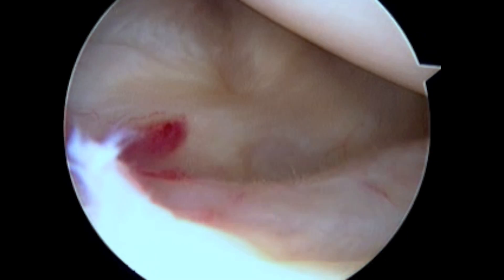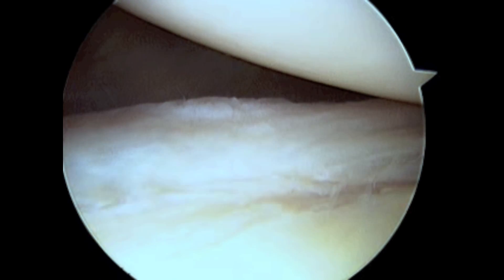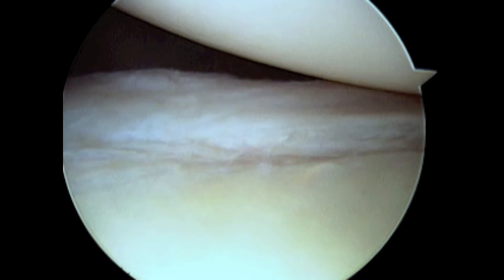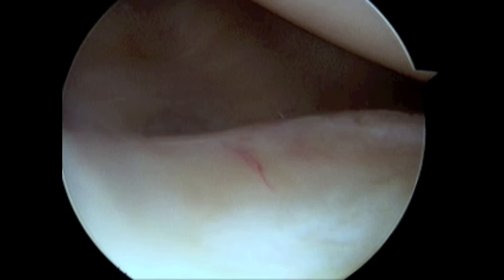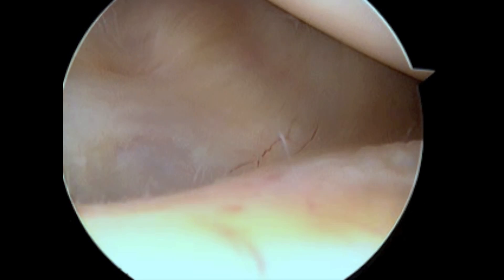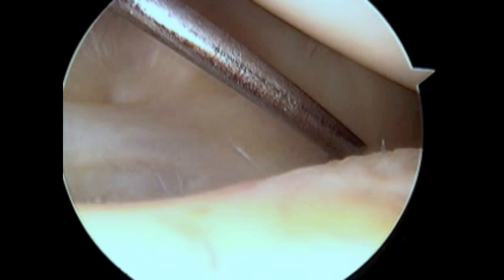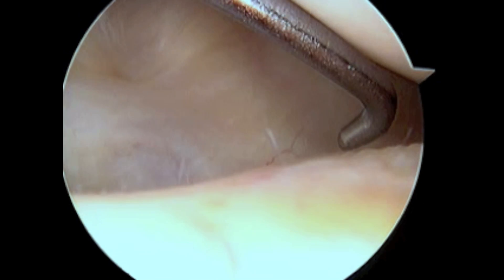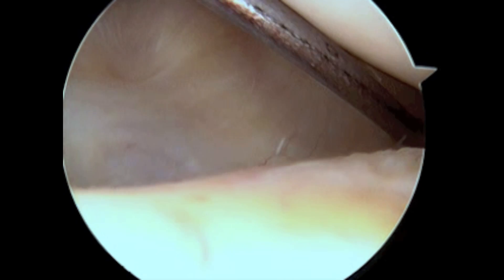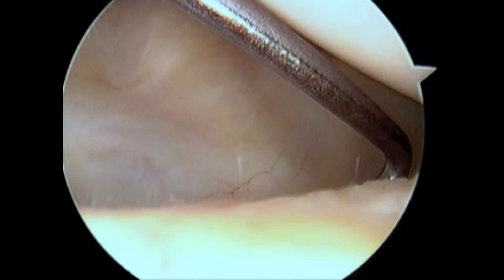As we advance the arthroscope anteriorly and inferiorly, you can visualize the inferior glenohumeral ligament, which originates as a portion of the fibrous glenoid labrum. The inferior glenohumeral ligament is the primary restraint to anterior inferior instability of the shoulder joint.